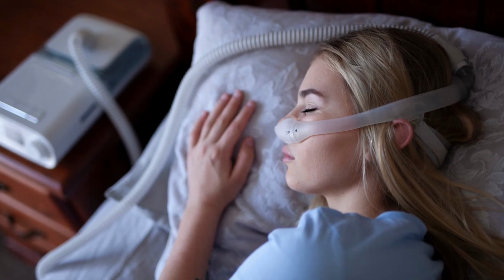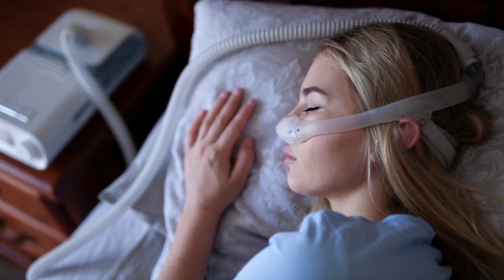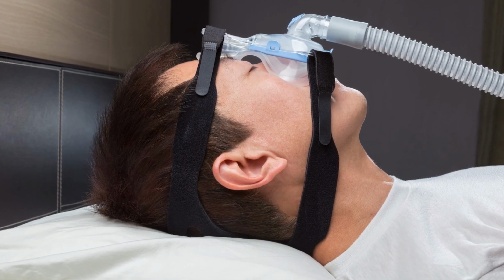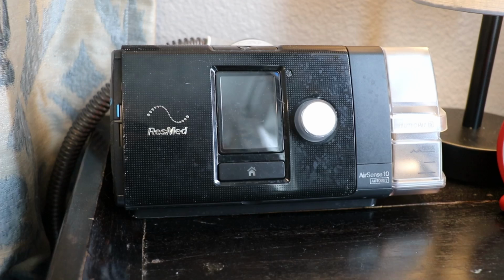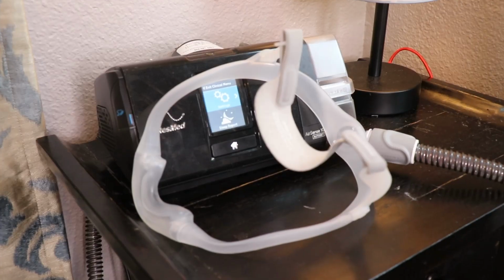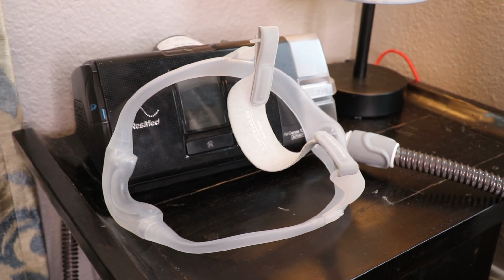CPAP stands for Continuous Positive Airway Pressure. This type of therapy is a common treatment for obstructive sleep apnea. A CPAP machine uses a hose connected to a mask or nose piece to deliver constant and steady air pressure to help you breathe while you sleep. I use the ResMed AirSense 10 CPAP machine. It's one of the quietest CPAP machines on the market. It's designed to keep you healthy and comfortable by automatically determining the lowest pressure needed for your treatment. It has a few different intelligent features like auto ramp and sleep onset detection.